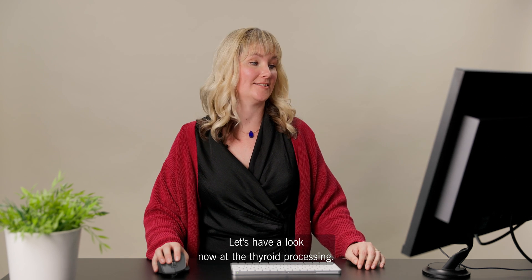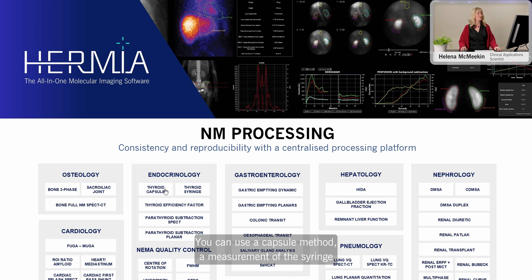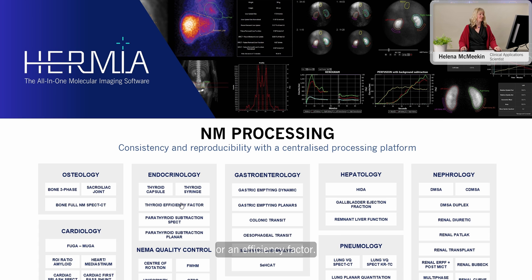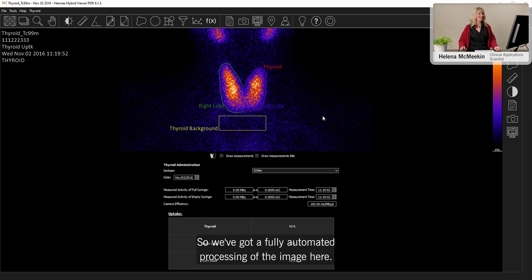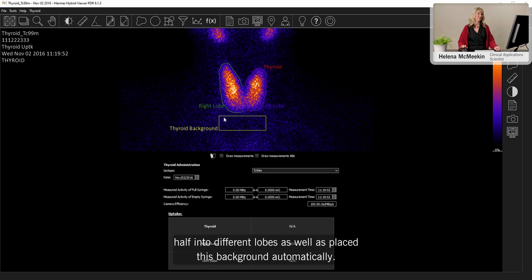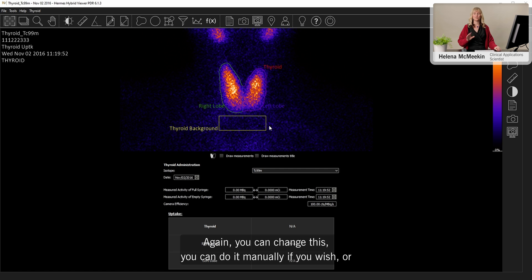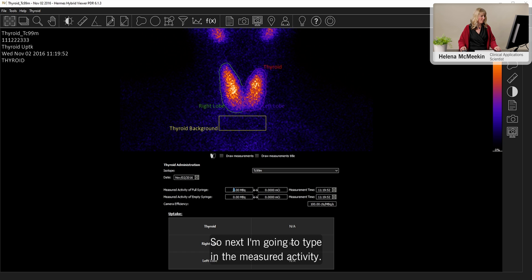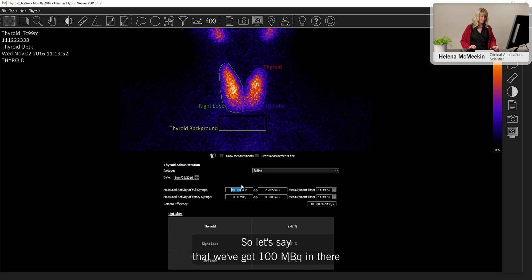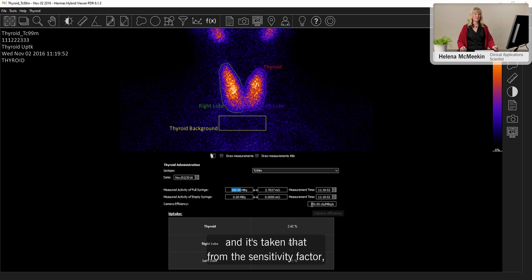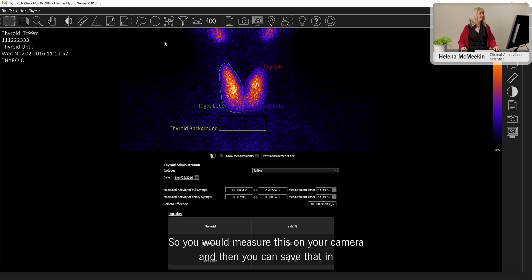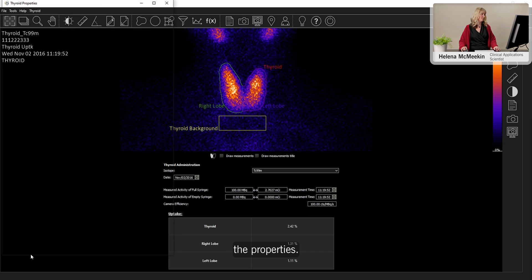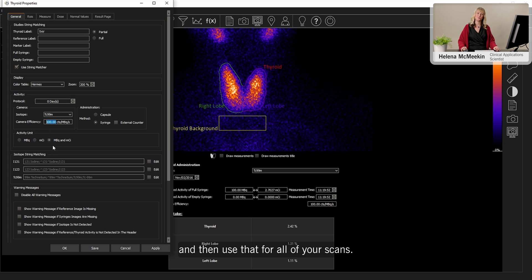Let's have a look now at the thyroid processing. So we have several methods for calculating thyroid uptake. You can use a capsule method, a measurement of the syringe or an efficiency factor. Let's choose the efficiency factor method. So we've got a fully automated processing of the image here. So it's automatically detected the thyroid and split it half-half into different lobes, as well as placed this background automatically. Again, you can change this. You can do it manually if you wish, for some reason if this is not correct for the patient. So next, I'm going to type in the measured activity. So let's say that we've got 100 megabecquerels in there. And as you can see, it's calculated the uptake in the thyroid. And it's taken that from the sensitivity factor, the camera efficiency factor that's been entered. So you would measure this on your camera. And then you can save that in the properties. So in this general properties tab, we can type in the camera efficiency here and then use that for all of your scans.